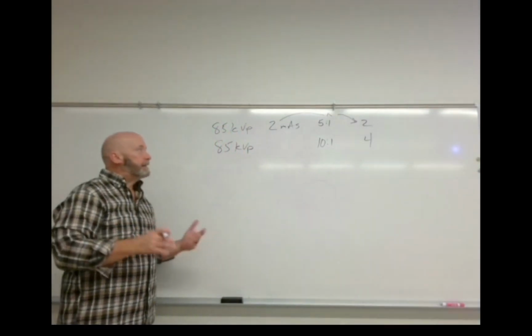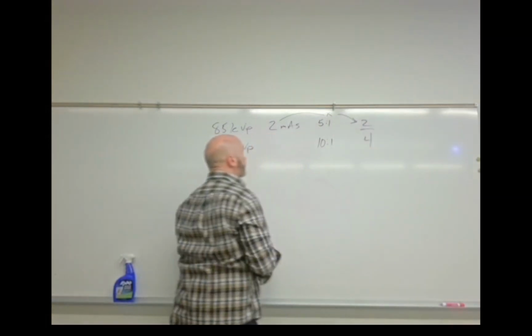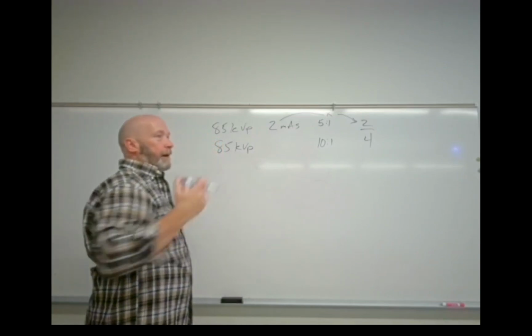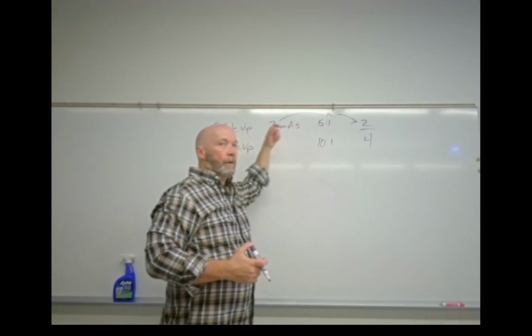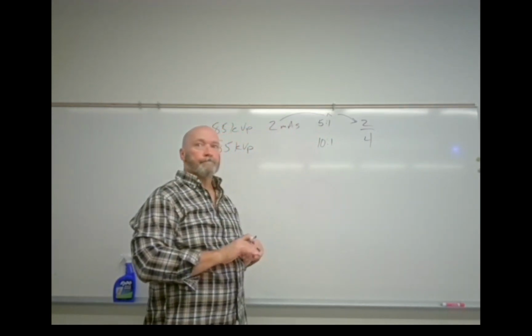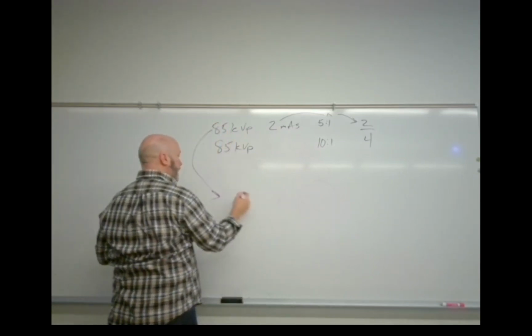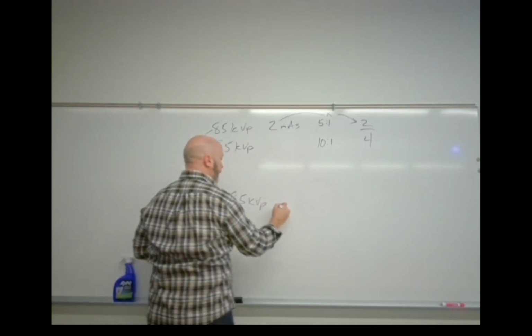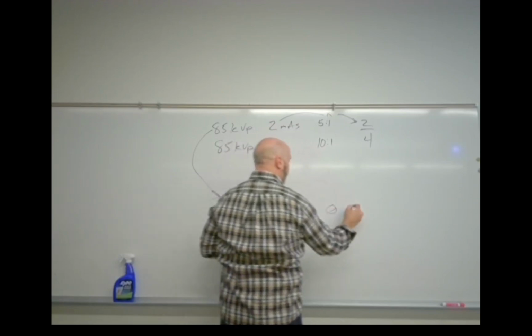I find the easiest way to do it is that if I've got a Bucky factor of 2, then if I remove that grid, what would my mAs be without the grid? It'd be 1, right? So without a grid, it'd be 85 kVp at 1 mAs without a grid.